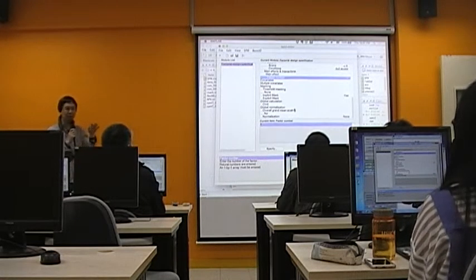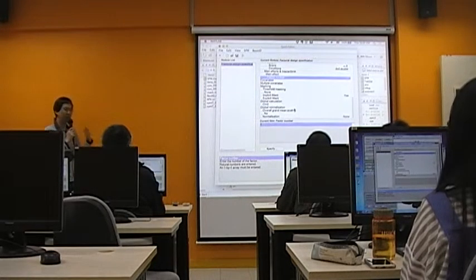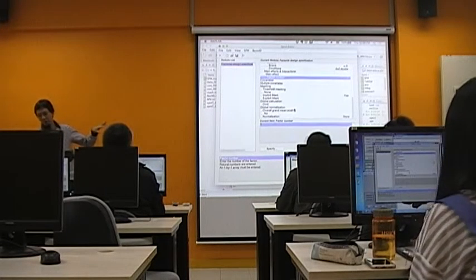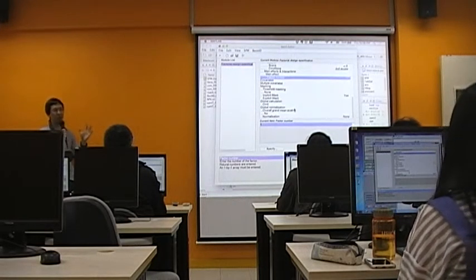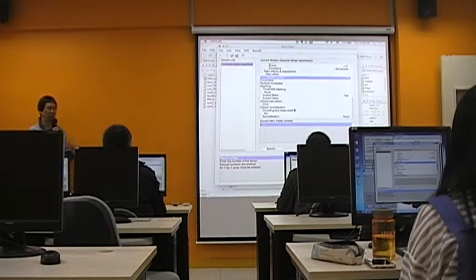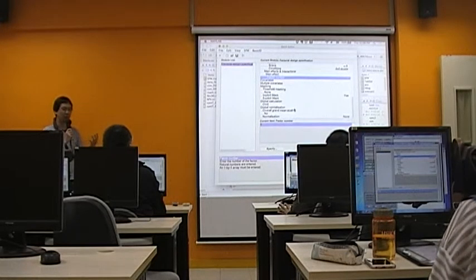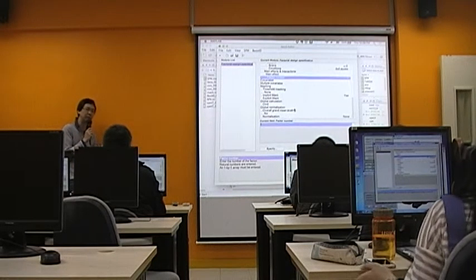It doesn't necessarily mean that you could do that now, because I just quickly went through, so maybe you would forget, and then there will be confusion about what you are going to set, especially concerning the conditions matrix. It could be very confusing. But at least I want to introduce this to you so that whenever you read about people using flexible factorial design, you know that they are trying to use a more sensitive way to look at the data.